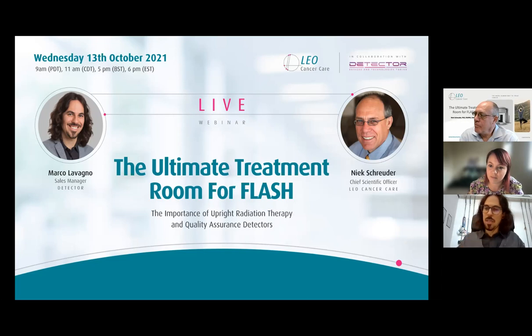So here we are talking about pulsed beams, I think. Am I right? Because each pulse for high dose of flash, the accuracy of measurements for each pulse. So if we are talking about pulsed beam, it's a little bit different topic because the number of particles are all concentrated in a small amount of time. As far as I know, there are systems that are going to be developed with that kind of technique. I'm reading now, each pulse is around 10 microseconds for proton beam.